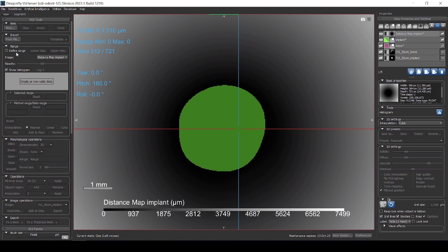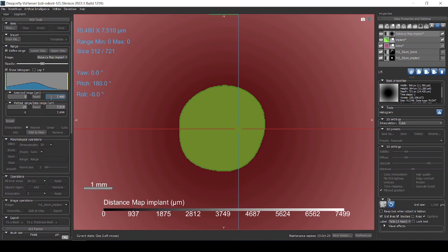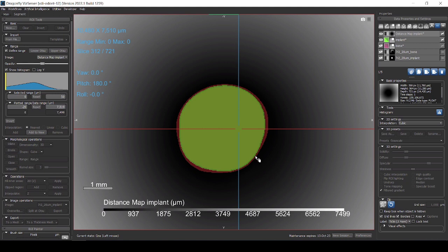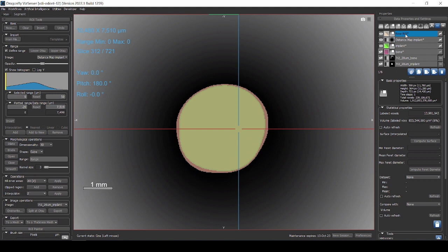If I come to the segment tab here and I select, I go for define range, I can see again here that the range goes from zero to seven point five millimeters. And let's say that I want to have a look at how much at a distance from, let's say, only 50 microns. So if I select 50 microns, you can see already in red here the distance that is selected. And if I add to new here, I'm creating a new ROI, a region of interest. I'm going to rename it 50 micron distance.